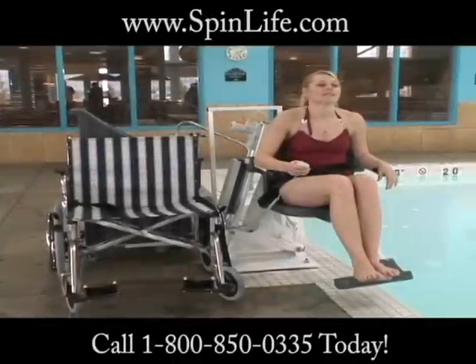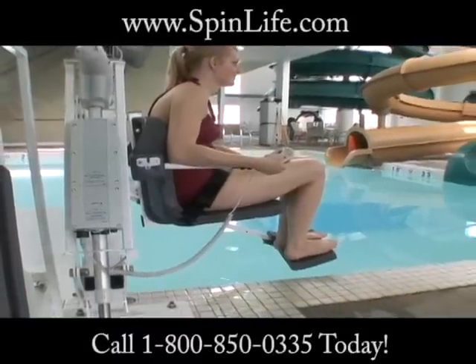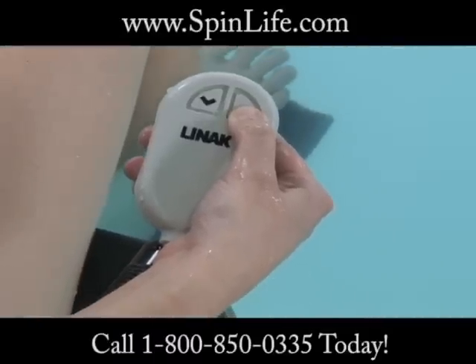With smooth battery powered push button control, the user can operate the lift from the seat, easily lowering or raising them into or out of the pool.